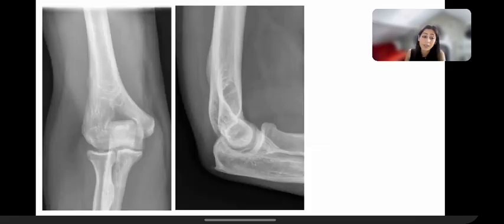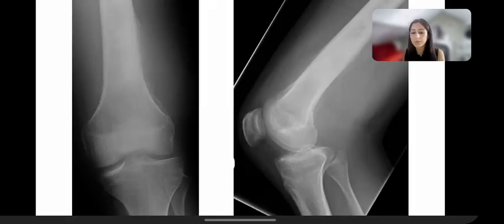Now, mostly your bone tumors haven't really read our books, right? They don't always present with all these 5 findings. You have to look for subtle findings.